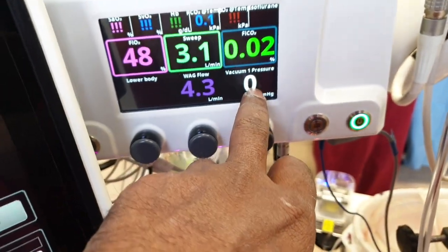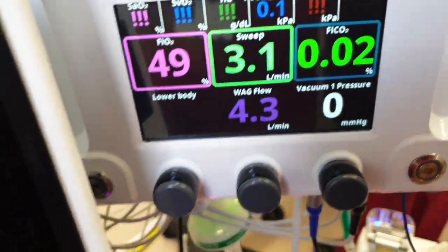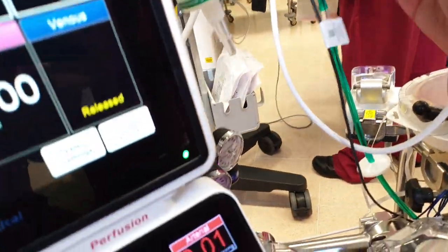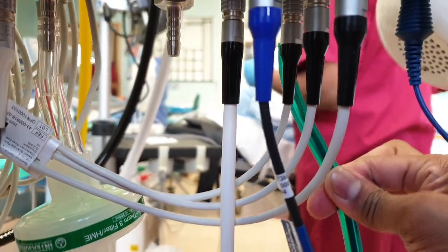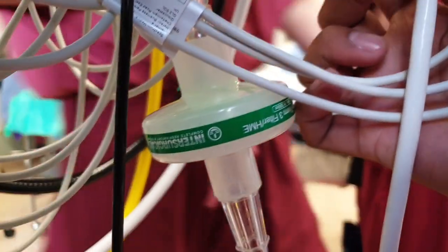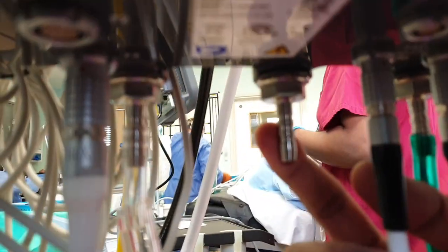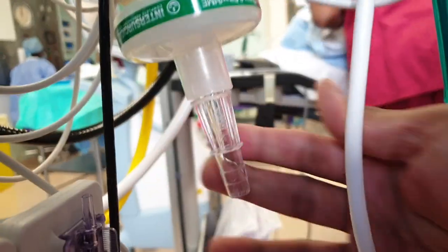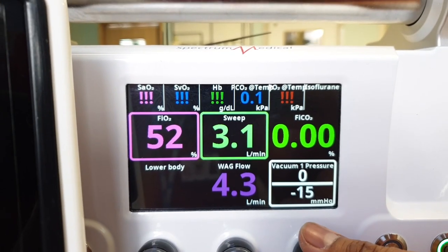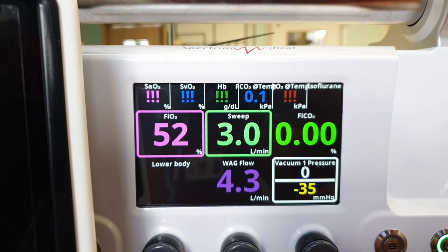What is on this? Your design. The vacuum module is still integrated here. This is your oxygen out, and this is your vacuum. If you want to do the VAVD, just connect here, and then this is your waste gas. Plug that in, and then set it. There you go.